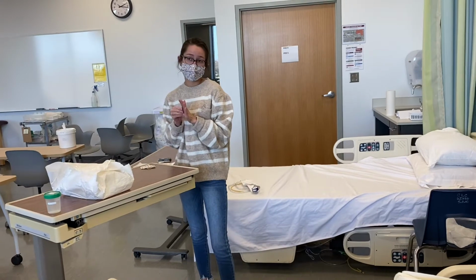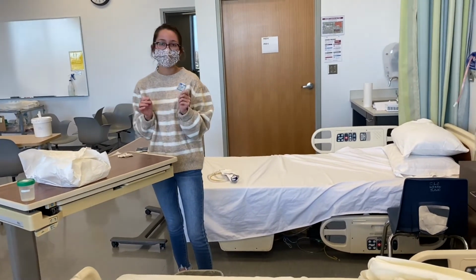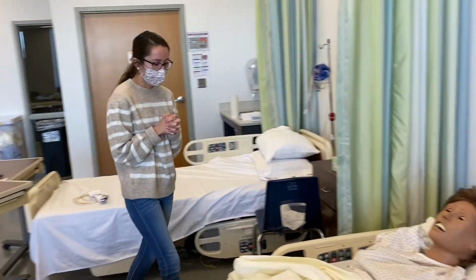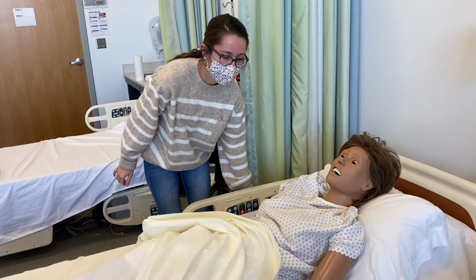I should have performed hand hygiene when I came in, but I didn't, so I perform hand hygiene now. And we do not have any hand sanitizer, so we're using alcohol pads. Okay, I am then going to raise my bed to a waist height.